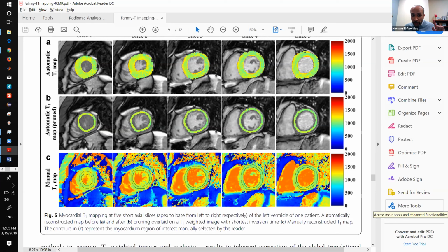if you're talking about using the neural network directly to register the images, I think it needs a lot of development, because, for example, using a recurrent neural network to deal with a sequence of images, training of recurrent neural networks is still complicated. So I don't think it's straightforward to apply neural networks for registration.